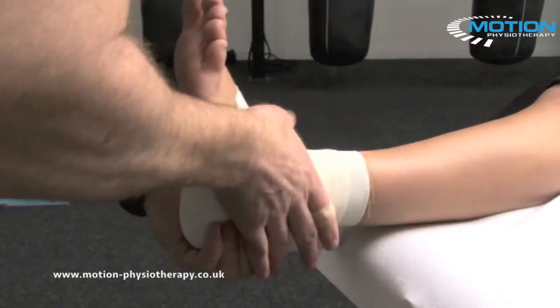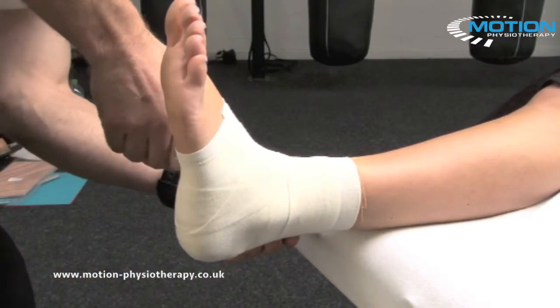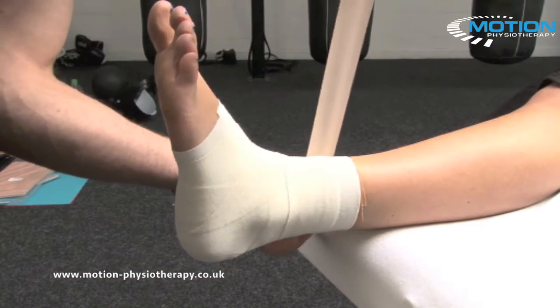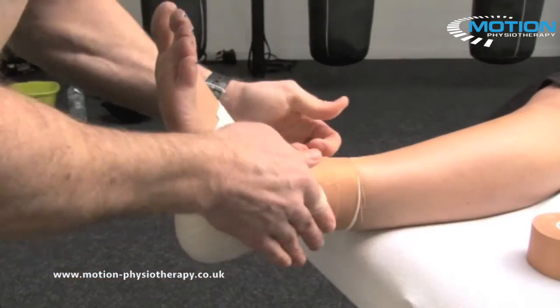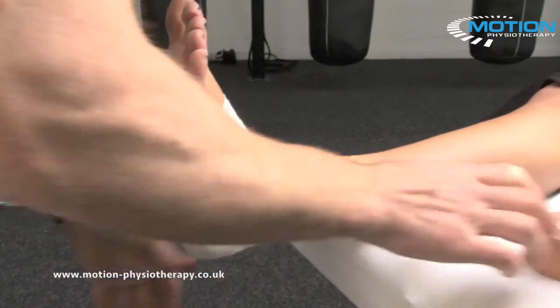Press it all down, then one complete loop just to finish the technique. And that's a lateral ligament complex strapping technique completed.